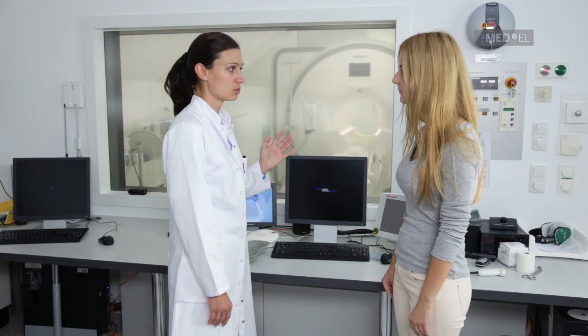Using headphones may reduce the noise. Advise the patient to indicate if any possible discomfort arises and to request that the MRI be discontinued if needed.